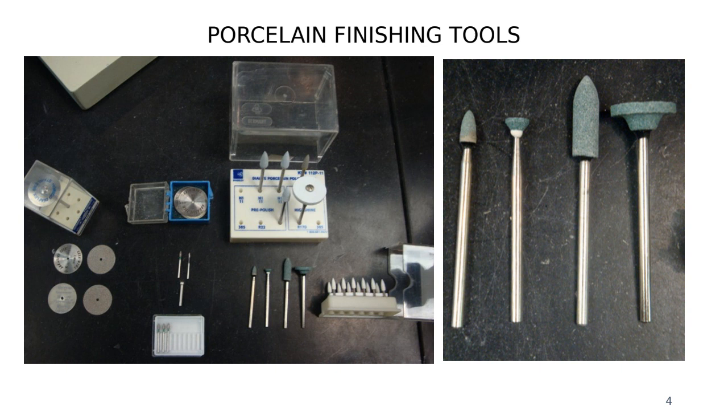Yes, you can use specific shapes and also you can use specific grades. So you can use coarse, medium, or fine, all right? It's up to you which one you're going to use, right? So the rule is you start with the coarse and then you go towards the fine, right?